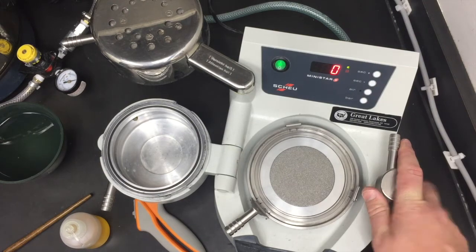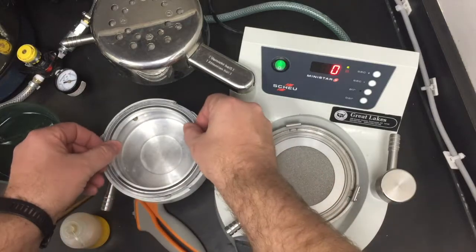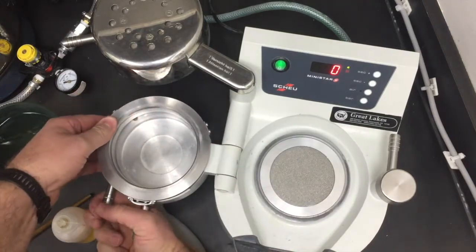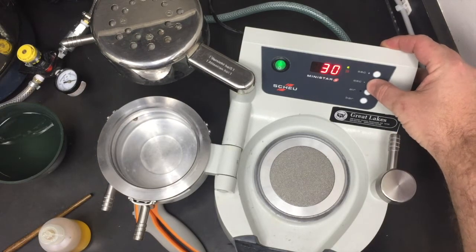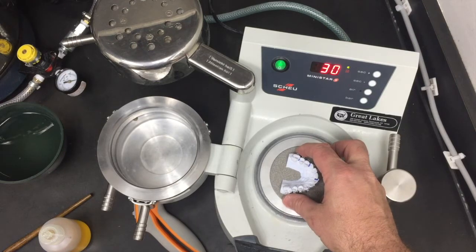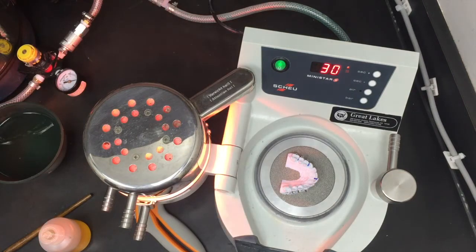So what we'll do is take our flexible sports mouth guard material, place it on, set the timer to 30 seconds, place the model in, and let it heat.